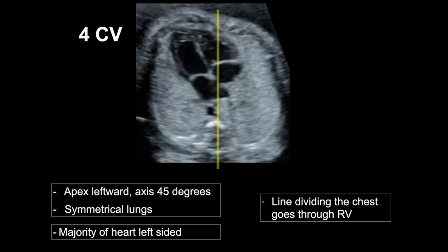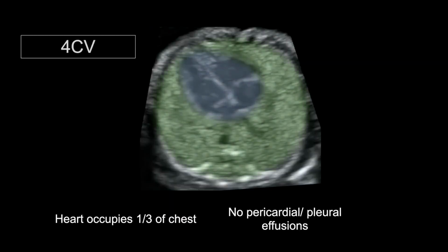When I draw a line from the sternum through the spine, that should traverse the RV with about a third of the heart on the right side of the chest and 2/3 on the left. The heart should occupy about a third of the chest, and you should document if there's any evidence of pericardial or pleural effusions.